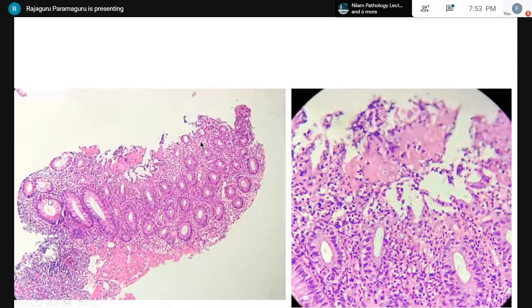Maybe there is focal basal plasmacytosis, but on the surface there is some kind of pinkish exudate. It didn't look so good, and there was some neutrophilic exudate as well, and this pink exudate had this kind of structure. So there aren't enough responses, so I'm just moving ahead.